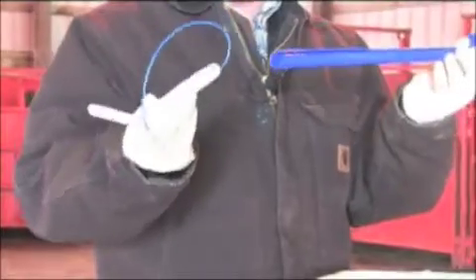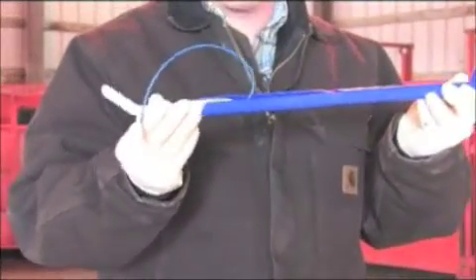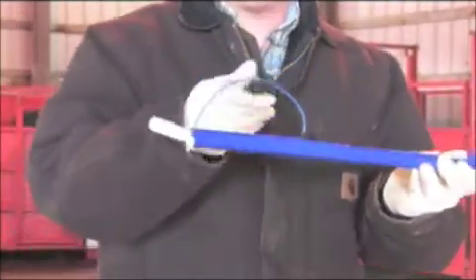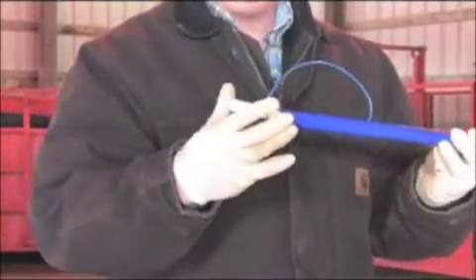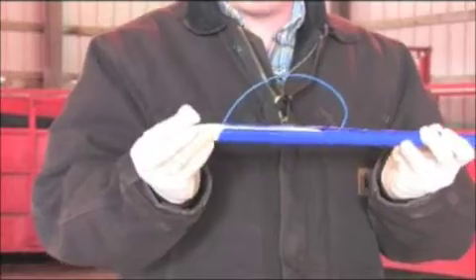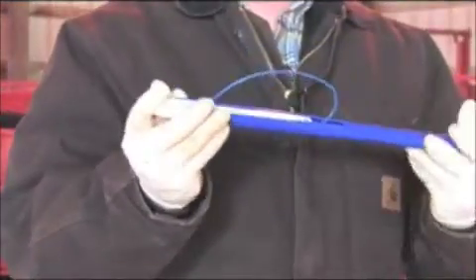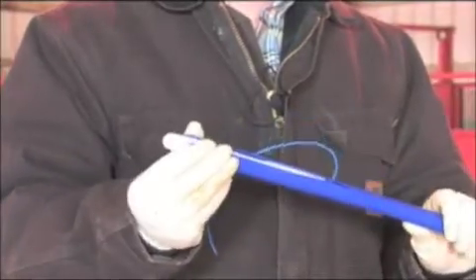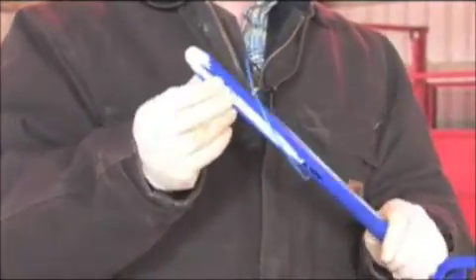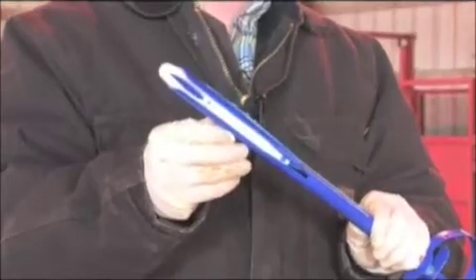Insert the tail of the CIDR into the applicator as such, trying to ensure that the tail is pointed down out of the groove. Next, fold the wings of the CIDR in, collapsing them together, and further press the CIDR into the application gun, trying to ensure that the wings come together at the end to minimize discomfort to the cow when inserting the CIDR.